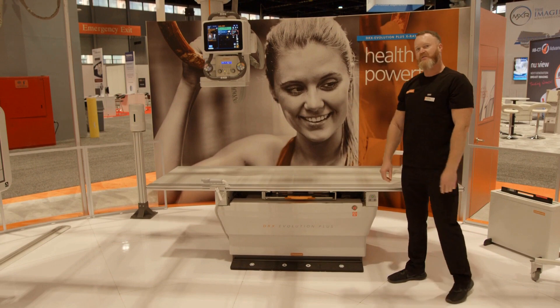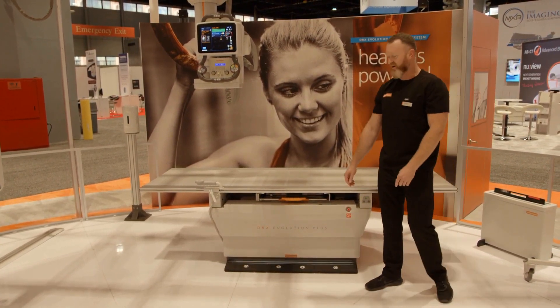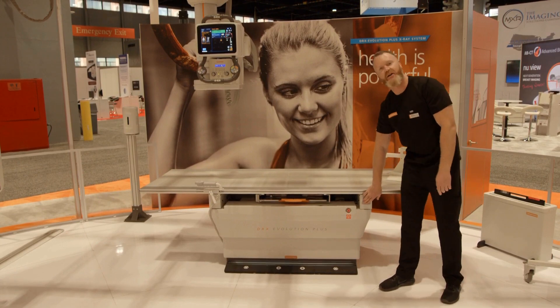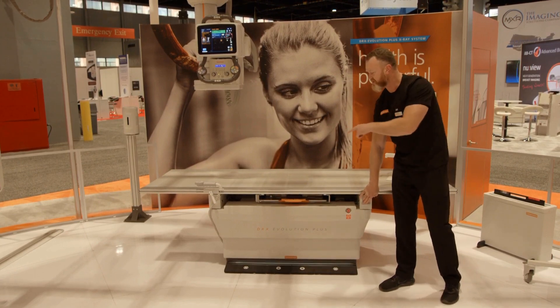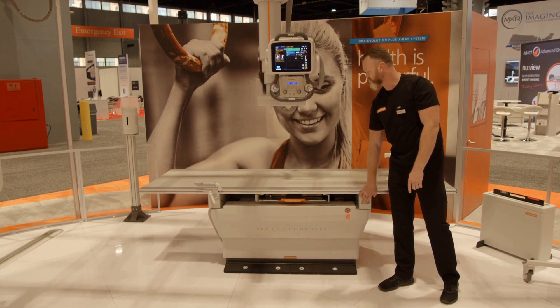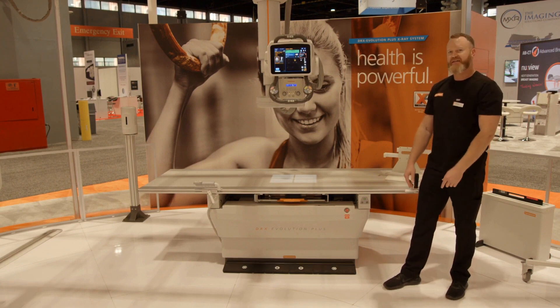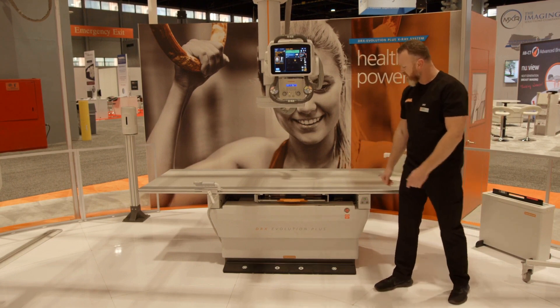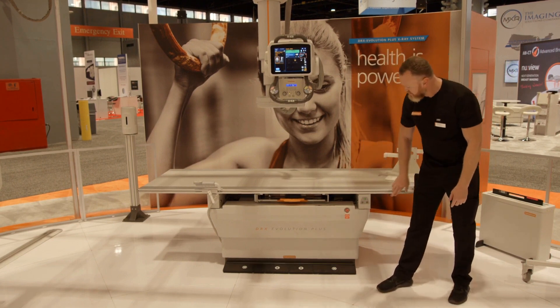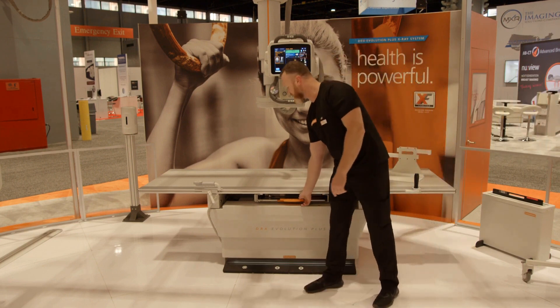Going into our full motorization and automation functions, we have things like auto-centering. I'm going to go ahead and auto-center this tube to my bucky tray. You can see the collimator light is going to come on indicating that the motion is complete. We also have auto-tracking, so when I engage that from the table, the tube is now going to track the bucky tray.